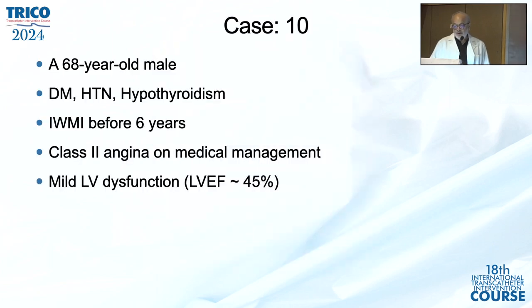I think the key was the wire passing, right? Yes. Once you get your wire in, and you don't try to cannulate the left main again. When you see the ostial left main, this type of dissection, remain away from the left main and do whatever you can do. That was the theme.